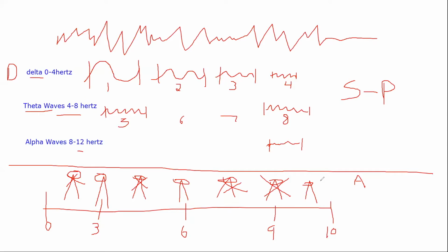So the reason we're always looking at the thetas is that lets us know how well the brain is focusing. The problem with getting rid of too much theta is now the brain's not resting enough. So as we work with you guys in understanding how to work with the program, we will be wanting you to focus on the volume of how much theta is in the brain, okay?